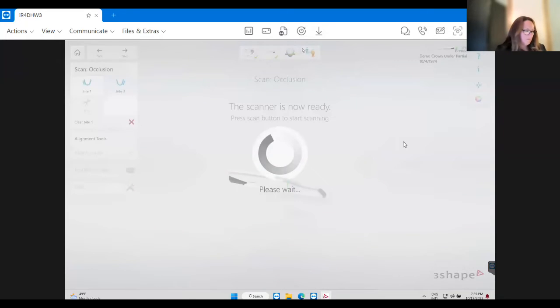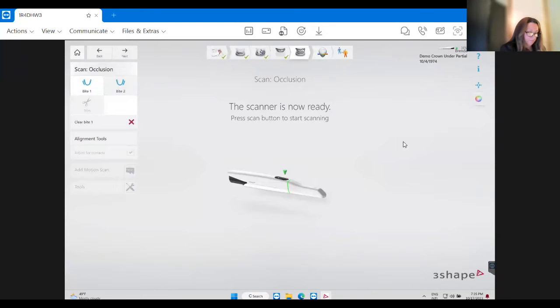So this is going to be very interesting. Before you do the bite, you're going to want to put the partial back in. Make sure it's seated correctly. And this is going to be almost like a Homer Simpson bite, because I do not have the actual upper arch for this lower partial.